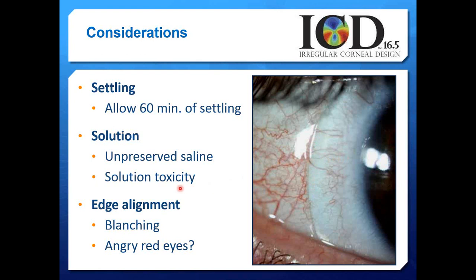Make sure that the patient rinses off the conditioning solution from the night before with their preservative-free saline. They don't insert the lens with any preservative on the back surface, and that'll reduce any solution toxicities that the patient might have from the long hours of wear during the day.